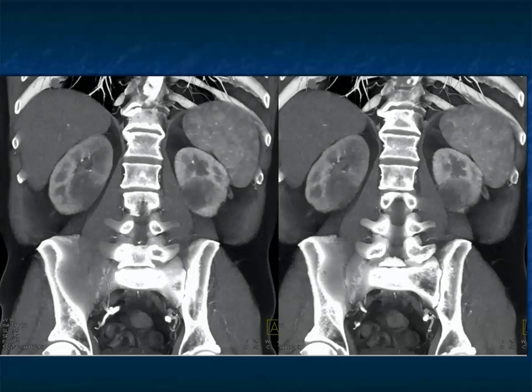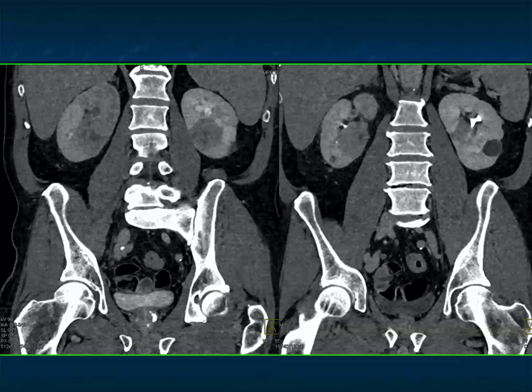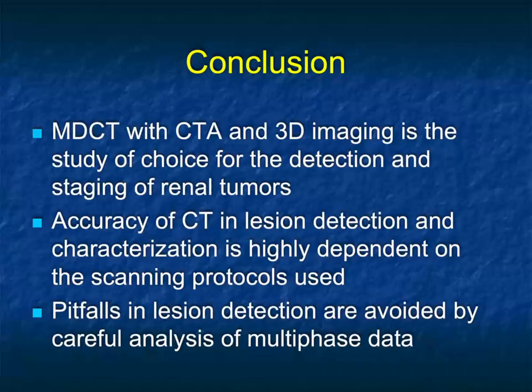Again, that same principle. You have to think about other sites of disease, and then you think about metastasis to the patient's kidneys. Again, mets to the kidneys are typically hypovascular. You can have contralateral mets from a renal cell carcinoma like a clear cell, but here, bilateral hypovascular lesions, think lymphoma, think metastatic disease. Just a very, very nice example. Can you get bilateral transitional cells? The answer, of course, is yes, but this looks like solid masses and not TCC.